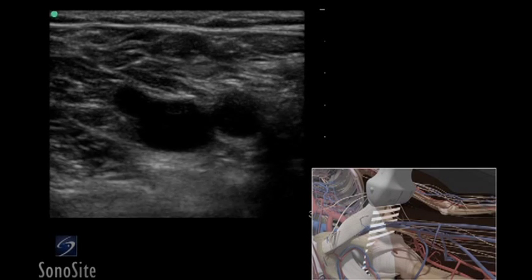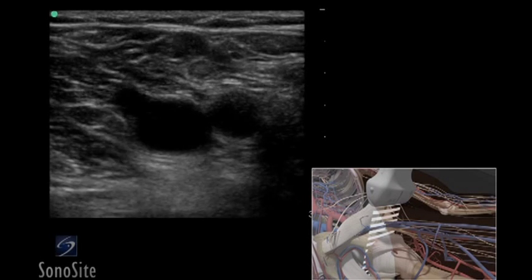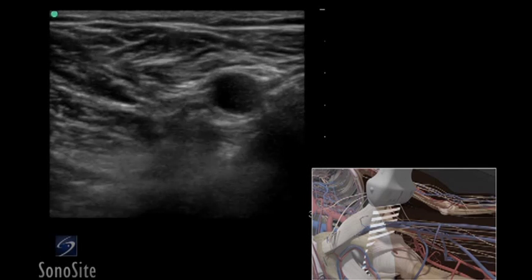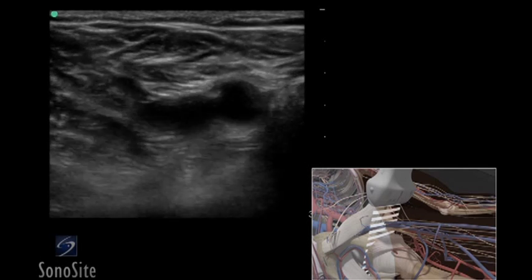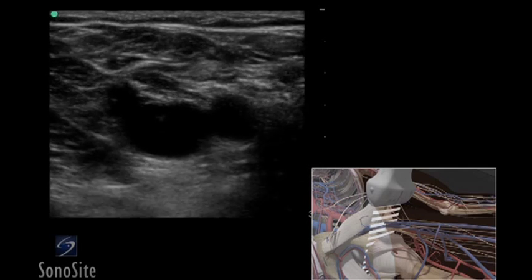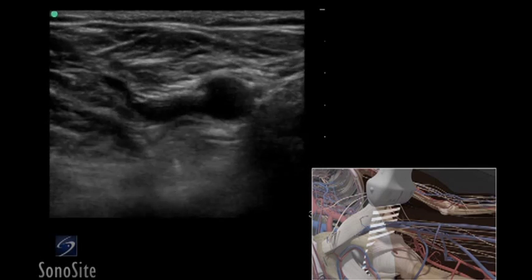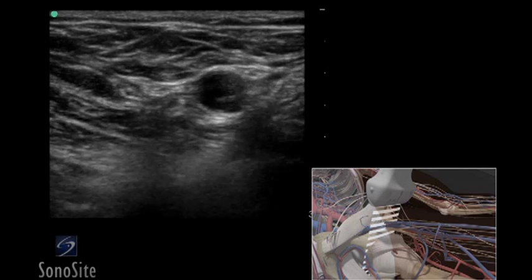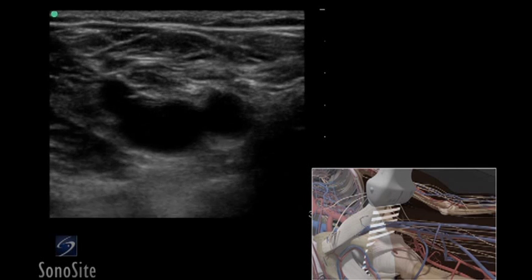A linear array transducer with a venous exam type is used to perform a lower extremity deep vein thrombosis ultrasound exam.